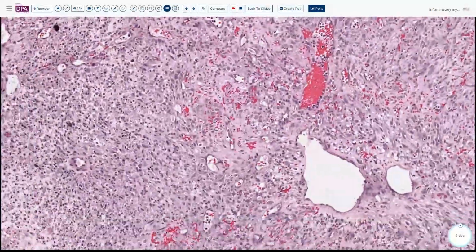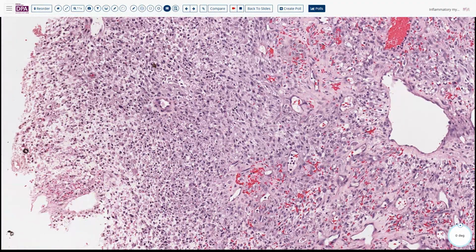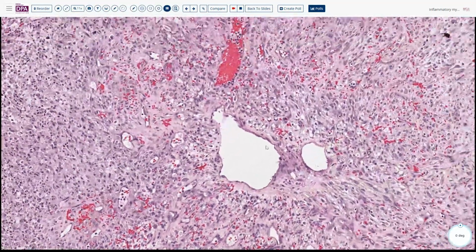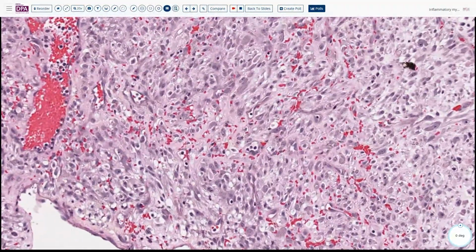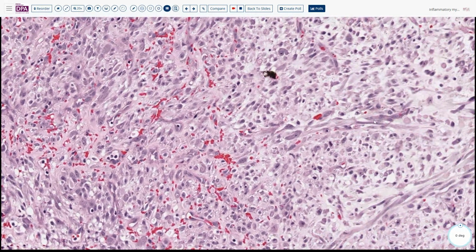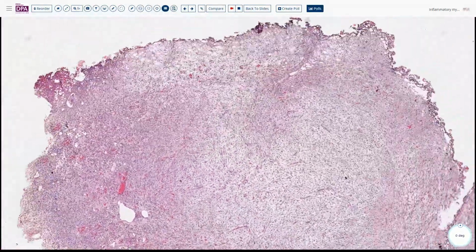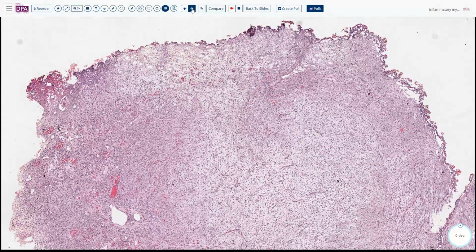here. We can see a lot of inflammatory cell infiltrate. And then we can have some neutrophils and plasma cells, especially if we find these two populations, you should think of this entity because this is inflammatory myofibroblastic tumor. So then take a look at the nuclear feature. You can see open chromatin, conspicuous nucleoli, and then this amphophilic cytoplasm. So this is maintaining the myofibroblast differentiation. So this is one of the examples of IMT. And then remember ALK.